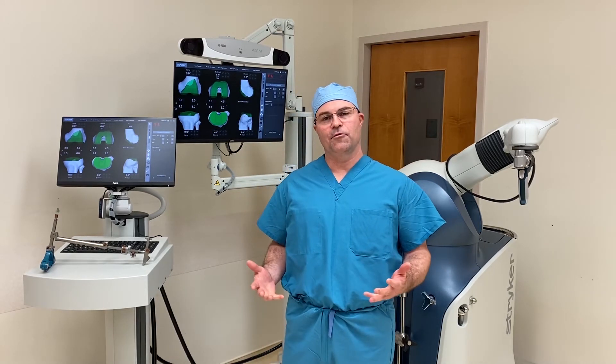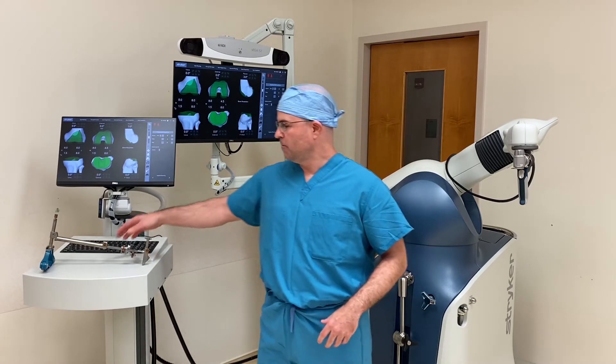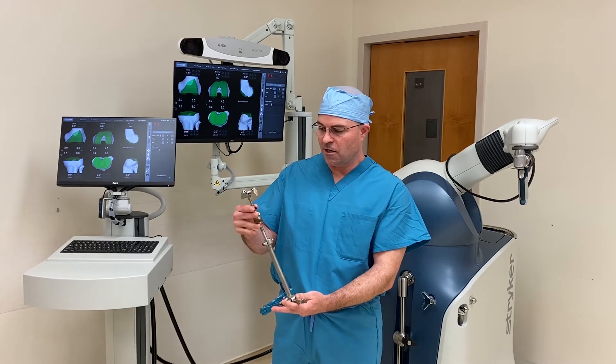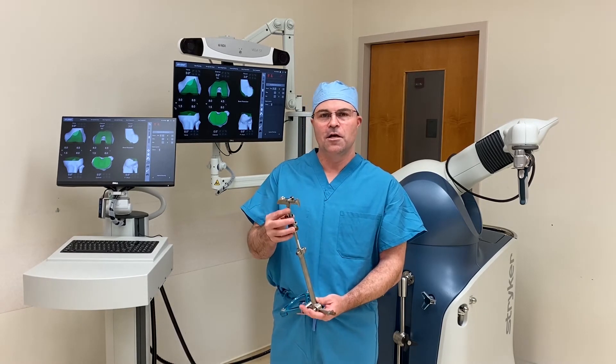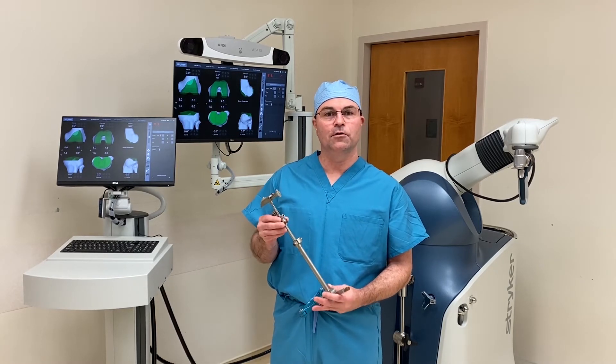Standard instrumentation stems from the 20th century, developed in the 1960s and the 1970s. Standard instrumentation would look like this — these are rods and jigs that are used to measure bone and resect bone and cartilage. They compare to the precision that's achieved with the robot, relatively crude.